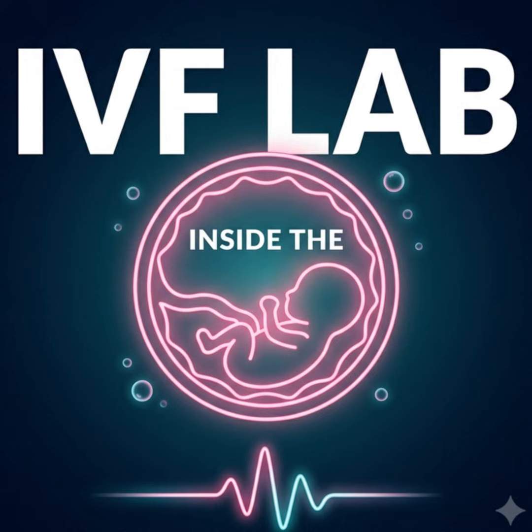Okay, so what happens next? The oocyte must be placed immediately into a warm, dark, tightly controlled culture incubator for a vital 2 to 4 hour incubation window. The cell just rests in the dark. It rests, and during those quiet hours, the cell's internal machinery powers up and goes to work. The cellular energy reserves are deployed, the tubulin proteins repolymerize, and the meiotic spindle completely rebuilds itself.